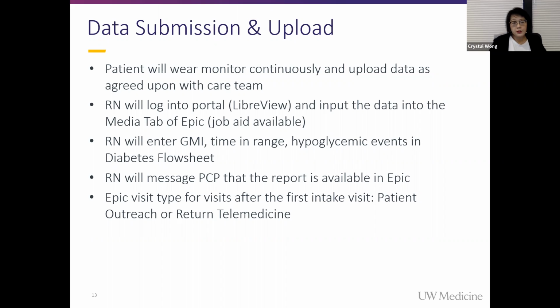This is the portal the patient uses. It's called LibreView. It's very easy. We're actually putting together a document that has all of the account names for all of the PC clinics, because the patient needs to input that so that they can sync their data with your clinic's account. We actually have a new tool in Epic that we didn't have for the pilots, so that you can actually trend the GMI, the time in range, and hypoglycemic events.